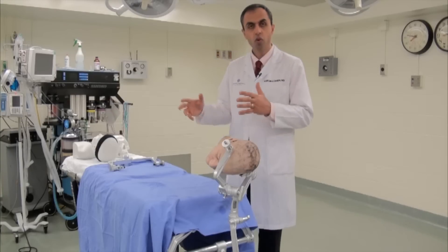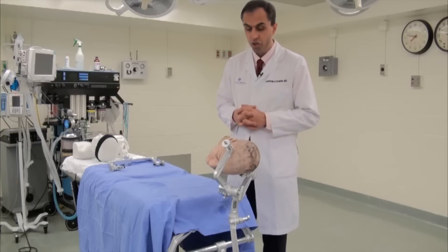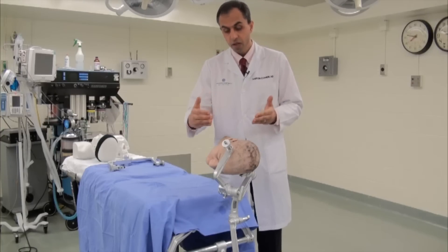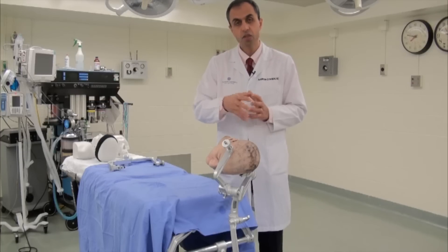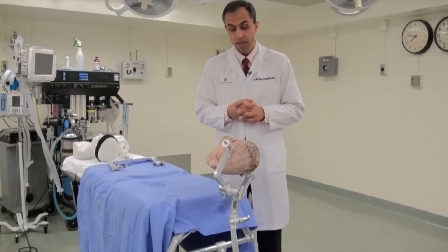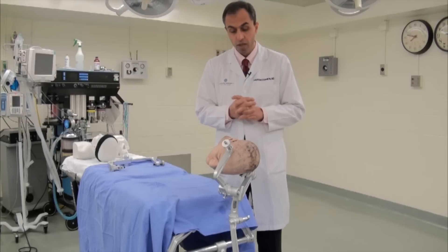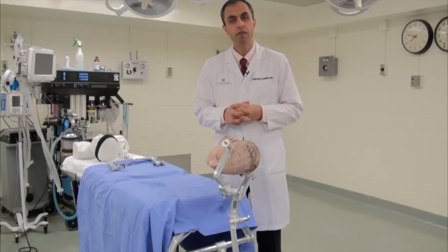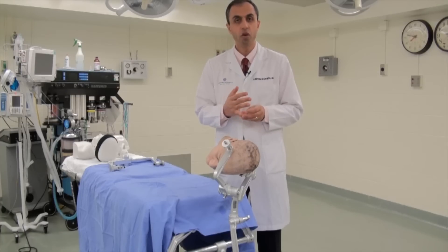After the torso is positioned, we focus our attention to position the head. As you can see, the head is turned slightly towards the floor to assist with going around the cerebellum during the later stages of the operation. We use the suboccipital approach very frequently — it's a very versatile approach for exposing acoustic neuromas.